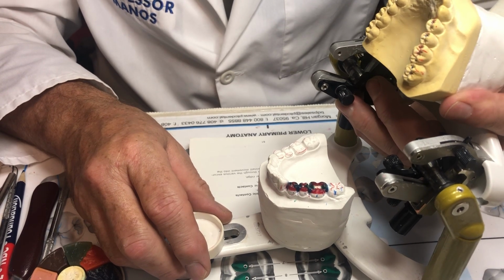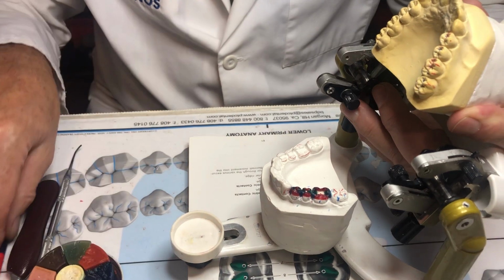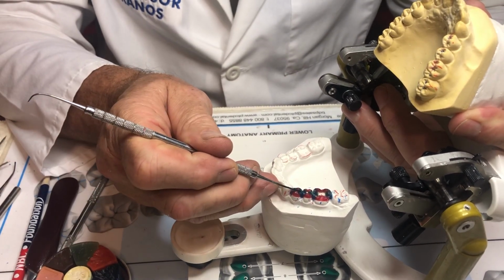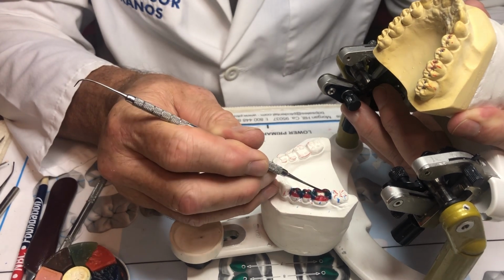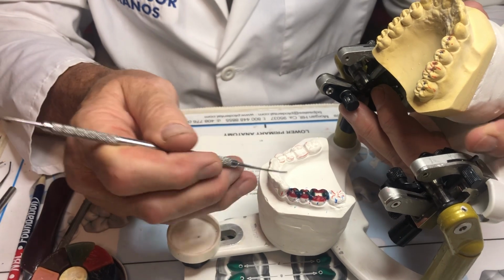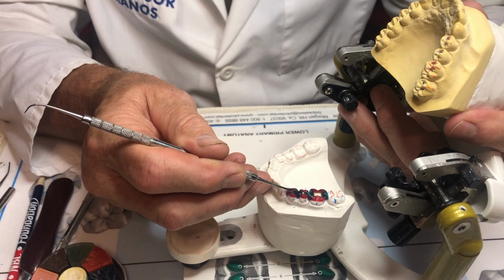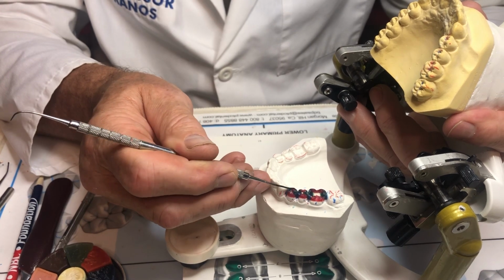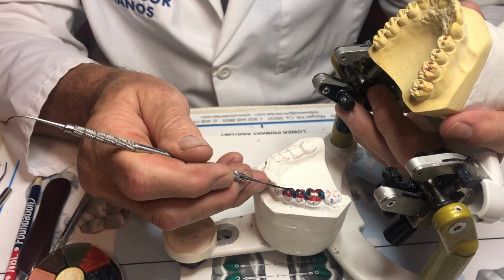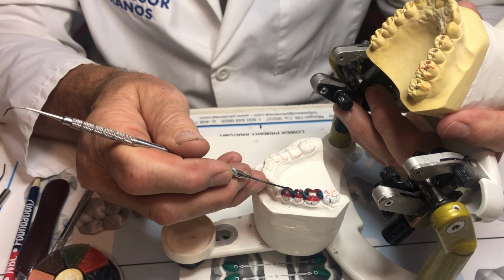So in the last video we did the mesial and distal marginal ridges. And if you remember from when we were looking at the book, the contact was on the distal marginal ridge. So we waxed distal, distal, distal. Once that was established and we hit the contact point, we closed it in centric, working, balancing, protrusion, retraction. Once that was done, we jumped over to the mesial. We know they're both the same size, so one matched the other. If you do it backwards, you'll have no idea. If you try to do both at the same time, you have no idea. So let's go with the plan and continue along.